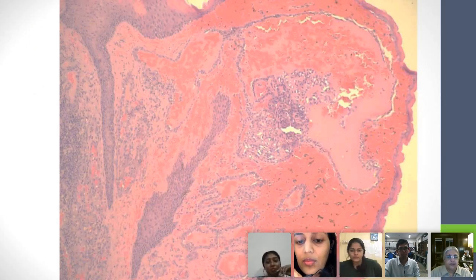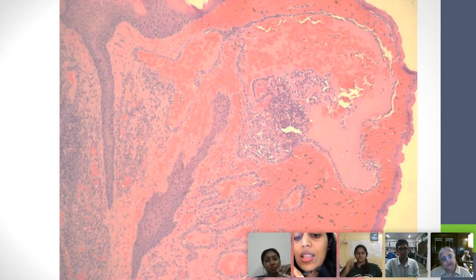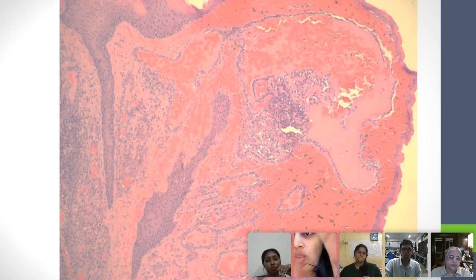Okay, come on now. Ma'am, this image shows a lesion with multiple cystic spaces along with large areas of hemorrhage reaching up to the mucosal lining. And the tumor cells seem to be arranged in, at this part, not very sure, ma'am, but a vague glandular pattern, surrounded by these lakes of homogeneous looking acellular eosinophilic material.